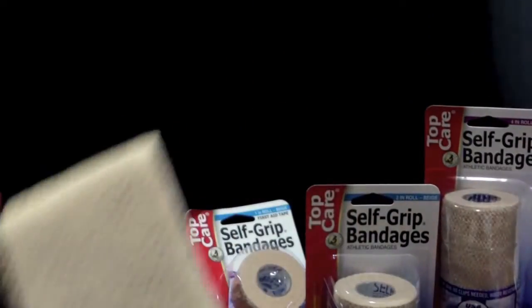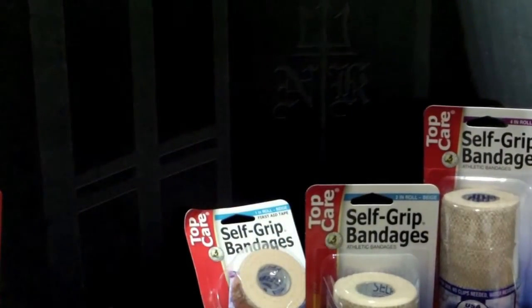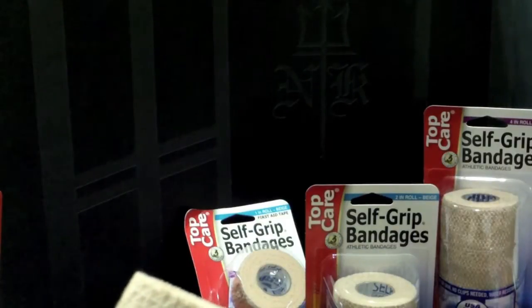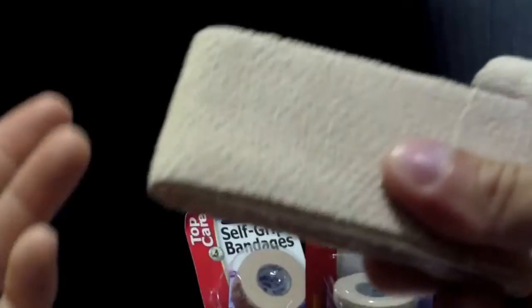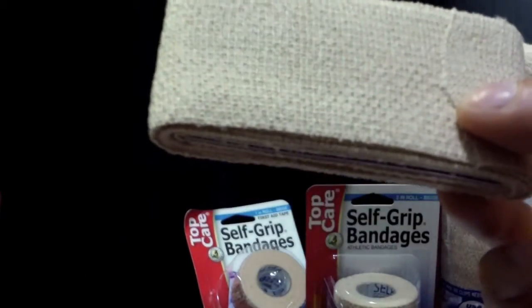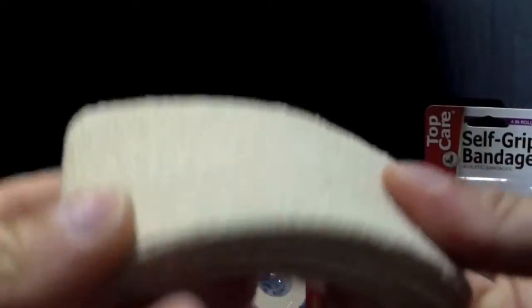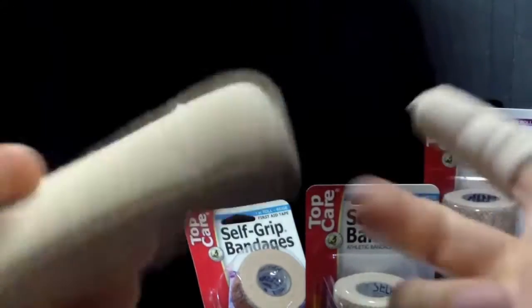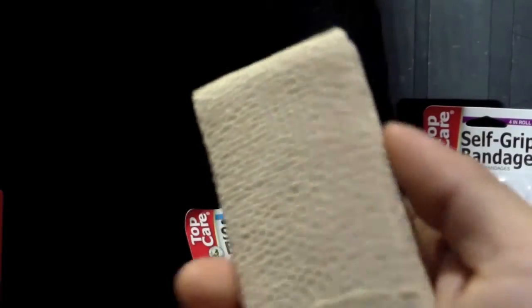And this is good because since I don't have a splint, if you have the skill and knowledge of how to wrap any type of sprain or injury like that, a mobility injury, then I have a couple videos uploaded on that. This is essential. This is great for even a cut perhaps on the foot where you need to support it, or you need some kind of pressure, this will provide that to a decent degree. And like I said, it's very functional. It breathes. And the goal here is all one-handed use.